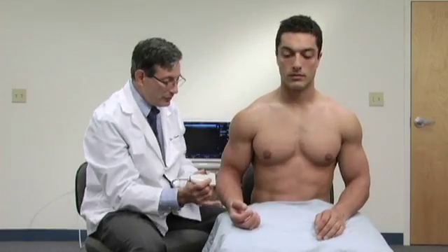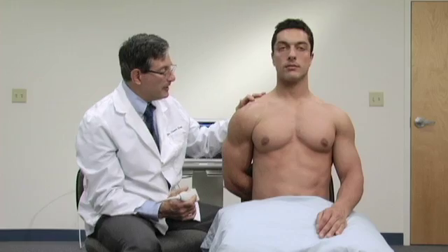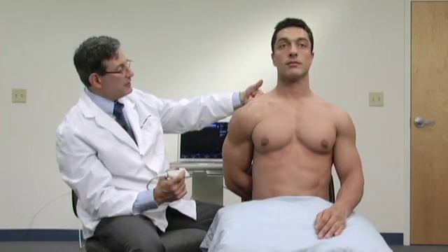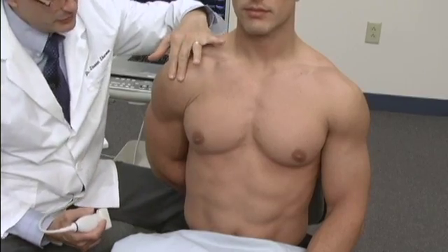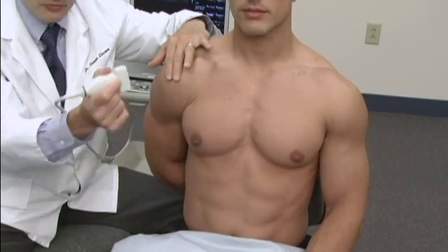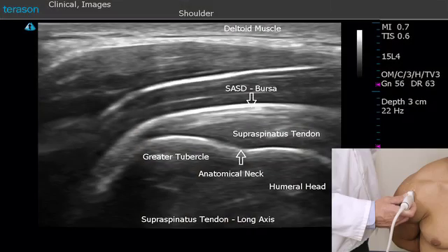I want him to bend forwards a little bit, put his arm behind his back, place his hand — or the back of his hand — in his opposite back pocket. In this position, we've taken the supraspinatus tendon from its neutral position and rotated it forward so that when we examine this tendon in its long axis, we'll simply take this probe and place it as such. If we place it in the front of the shoulder, we'll usually get a good view of the supraspinatus tendon.